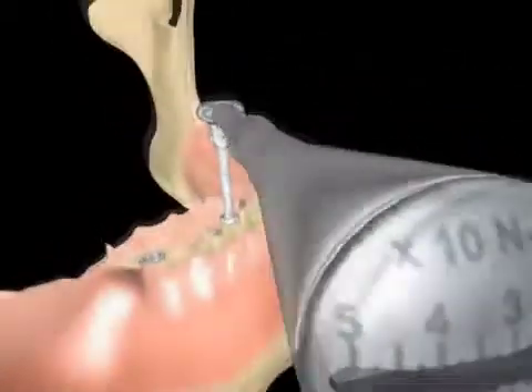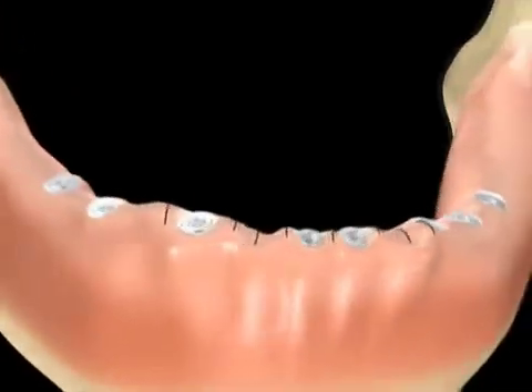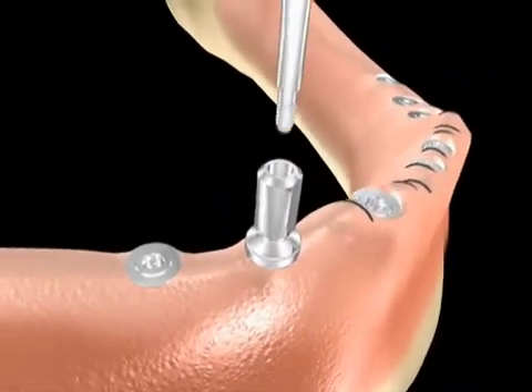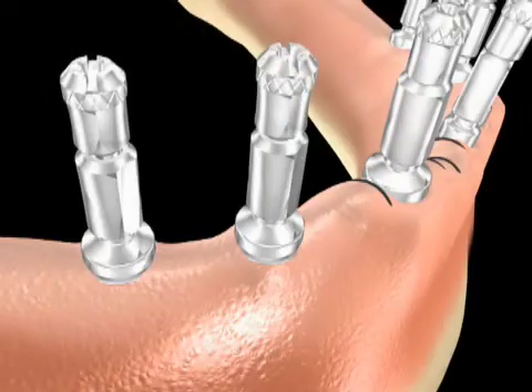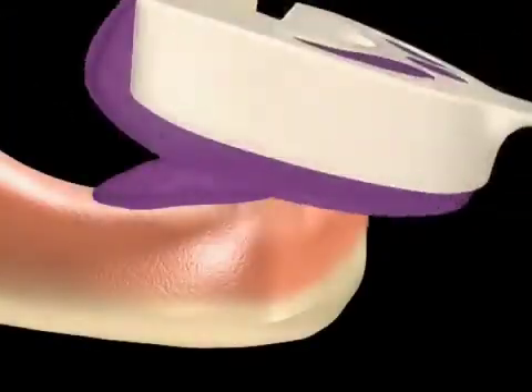The abutments are seated to a torque value of 35 newton centimeters. The case is now finalized and ready for the working impression. Flat-1 abutment impression copings are selected and secured by long impression screws. Notice the different impression copings matching each platform, 3.5 or 5 mm in diameter. An open tray final impression is then taken.